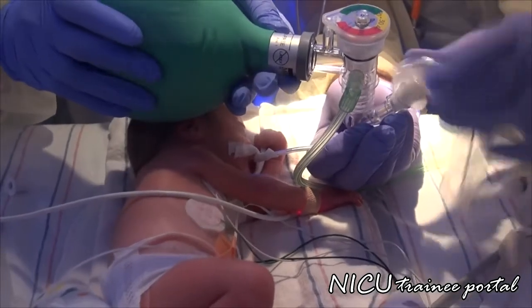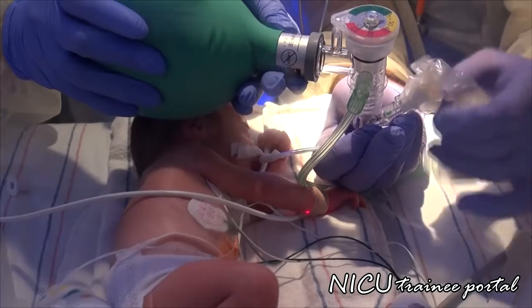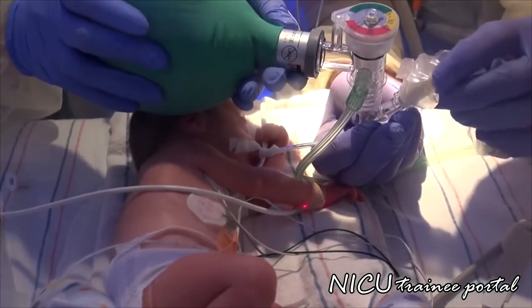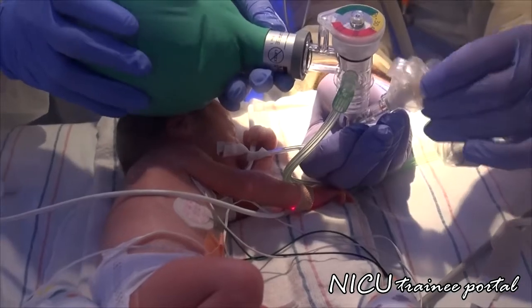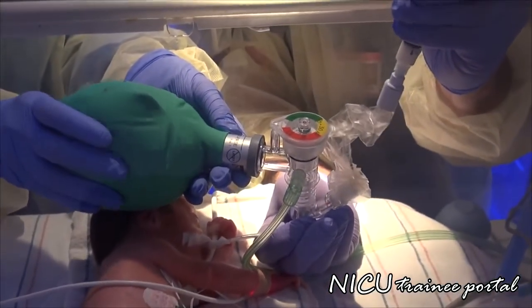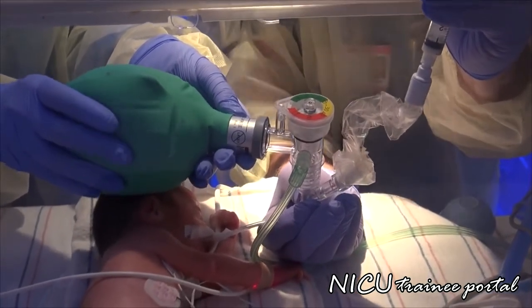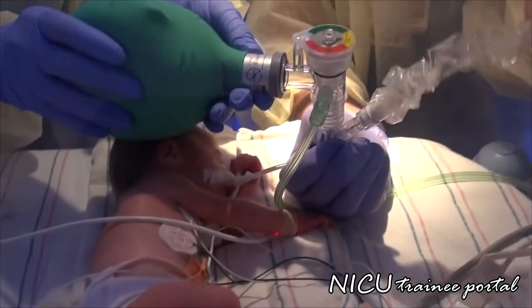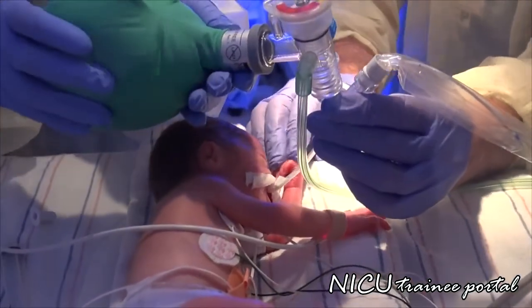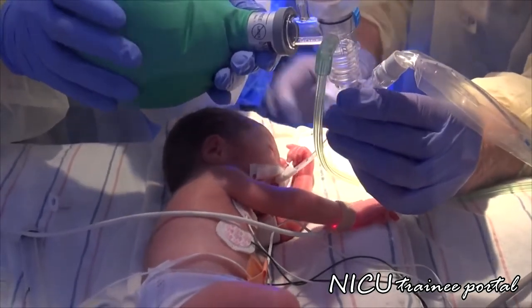He really likes the surfactants. That's great. Here we are. Just gonna put up on it. Looks good. The bigger kids, it comes right back up.